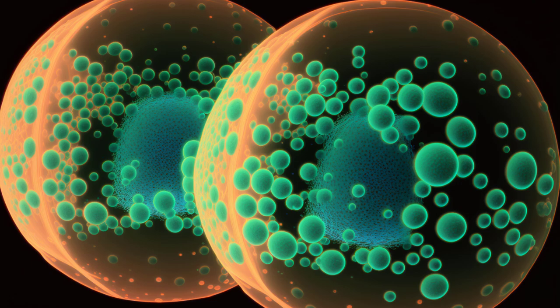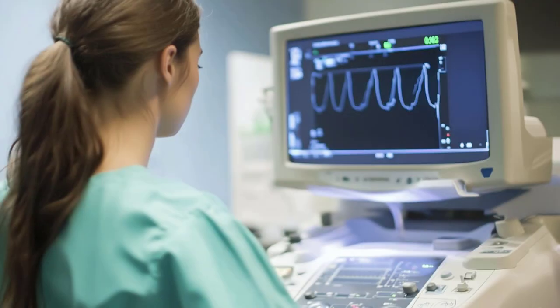For example, when a patient is injected with microbubbles, an ultrasound scan of the heart becomes much clearer because these bubbles strongly reflect the sound waves. Imagine a dark room where everything blends together. Then, sprinkle in tiny glowing beads that instantly highlight the edges of objects. These beads are like microbubbles, making important structures stand out.